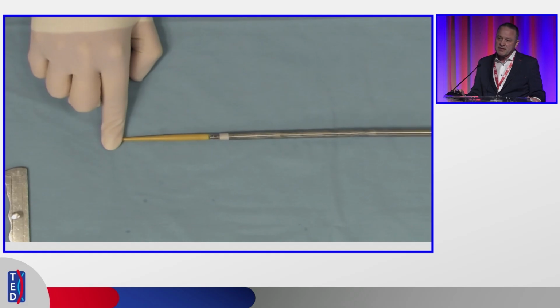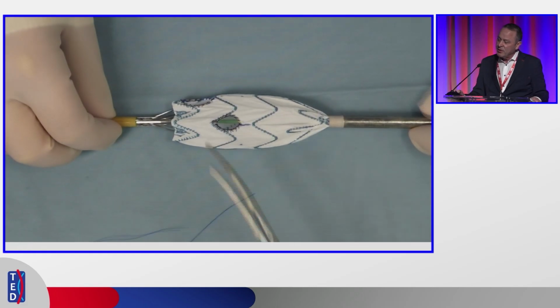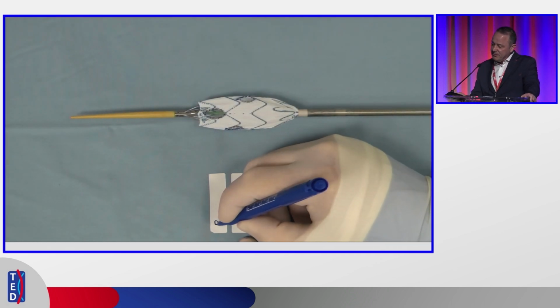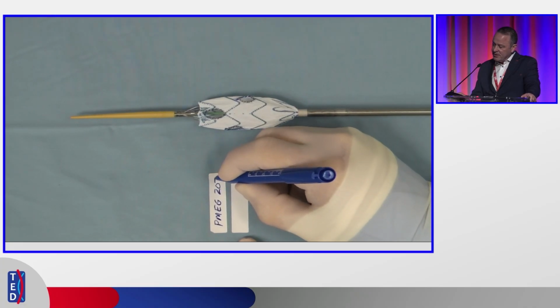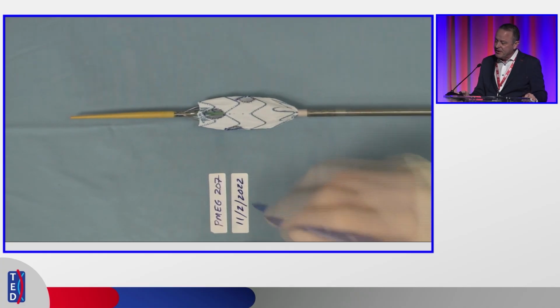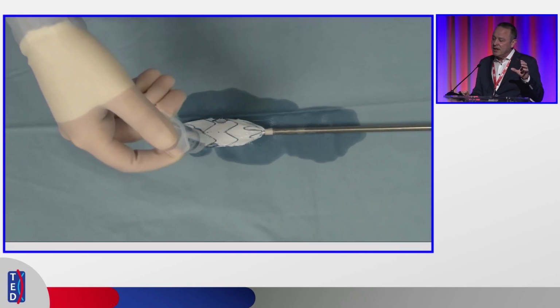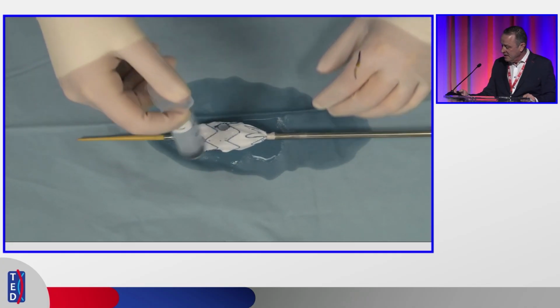I'm going to speed this video up for the sake of time, but you can see here, after we have created our 3-vessel modified graft, I believe this was done back in 2022, if I'm correct, we go ahead and reload this graft using specific tools. During the lunch symposium tomorrow, I'm going to show you some of the reloading tools that we have now that can standardize this technique.